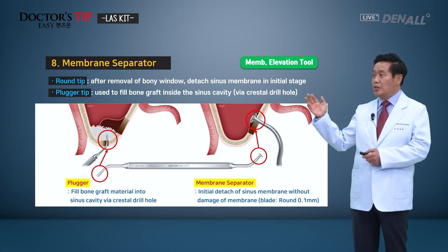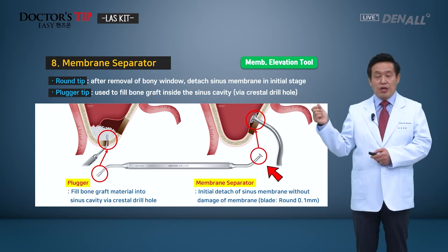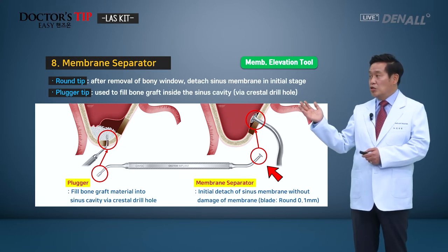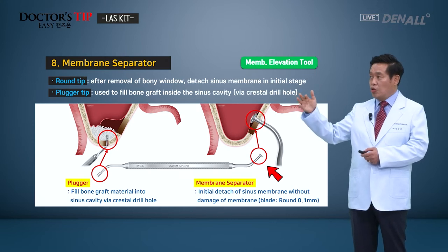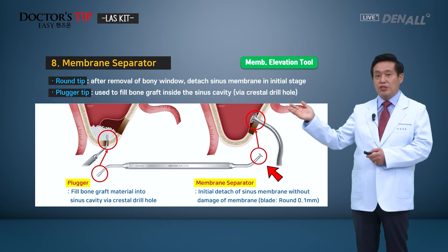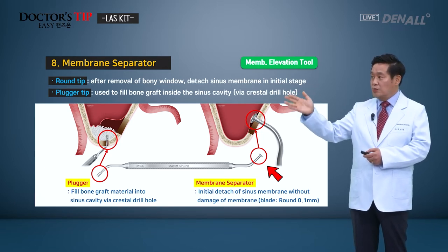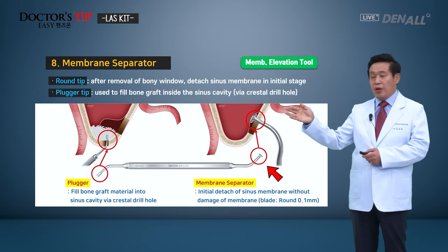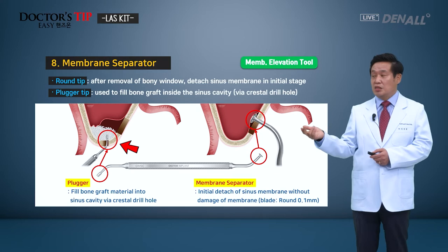Next is the membrane separator. One side has a dome shape, similar to piezoelectric kits, which you will think of. When you open the window, in other words, when you do the initial detachment, if you use this side of the tip, you can very easily remove the bony window and detach the sinus membrane at the initial stage.